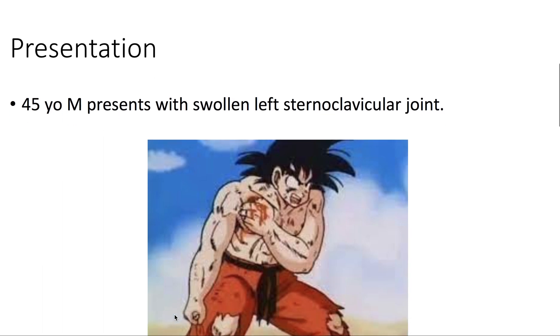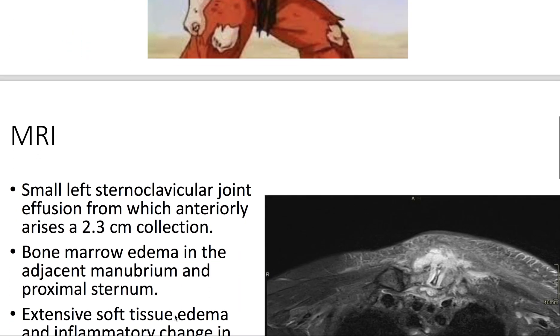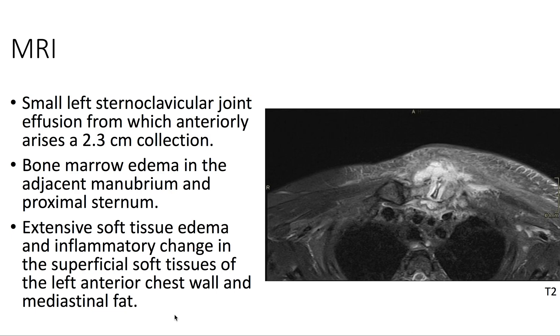Presentation: we have a 45-year-old male presenting with a swollen left sternoclavicular joint. On MRI, here T2-weighted imaging, we see a hyperintense, irregularly shaped 2.3 cm collection at the left sternoclavicular joint.